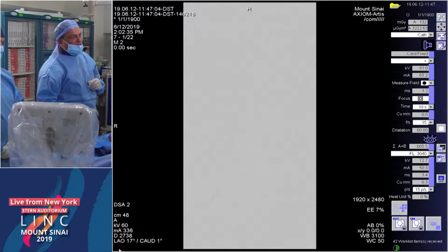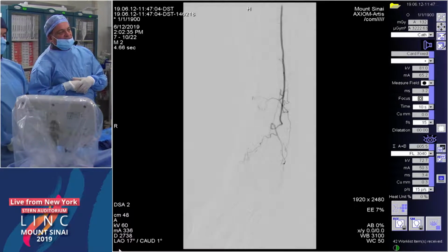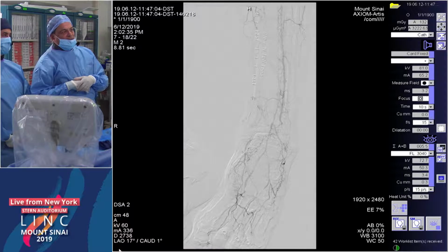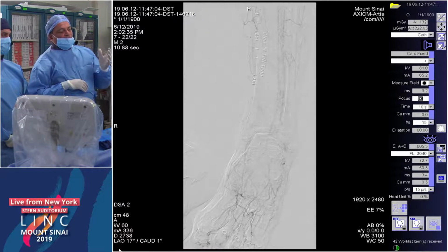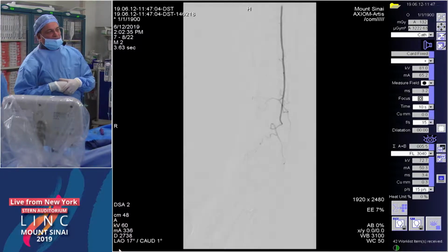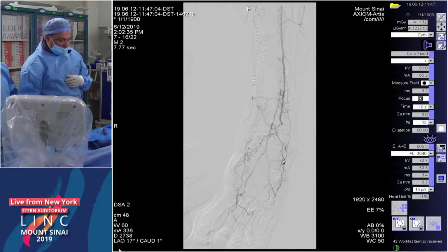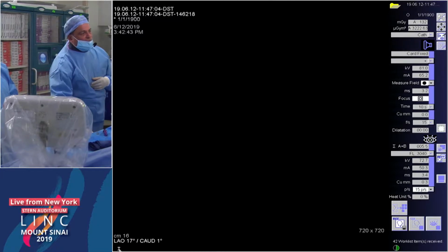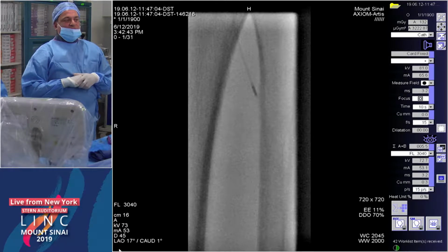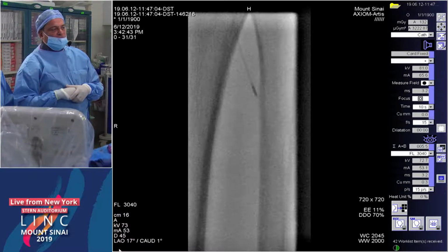We're using, rather than do pedal the way Andre did, I think the distal vessel is very diseased in this segment, and the peroneal is quite robust, and still the ulcer is non-healing. So what we wanted to do is do an antegrade approach and do wire escalation and talk about different wires that you guys would use so that the audience and I can benefit from your experience. So I've buried a support catheter, which is a Teleport catheter from CSI, which we find in coronary CTOs works really well.